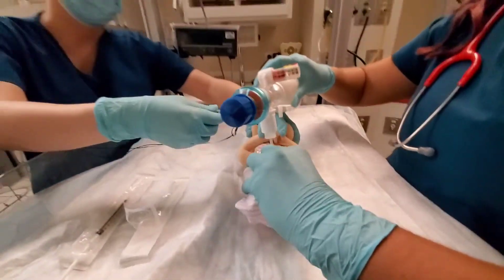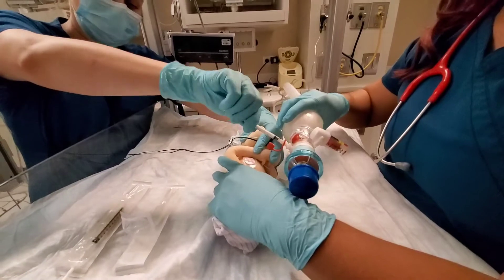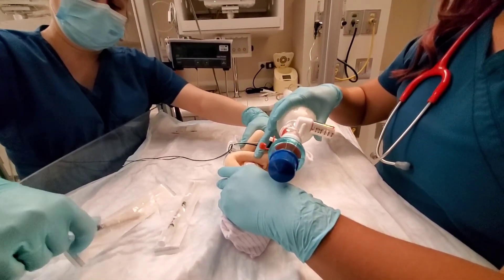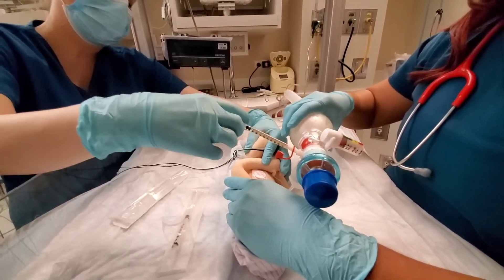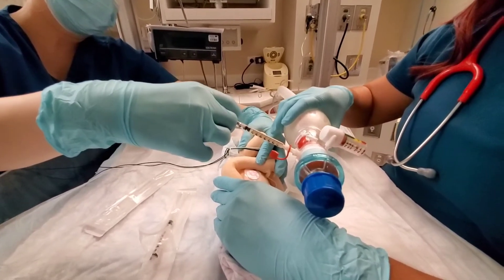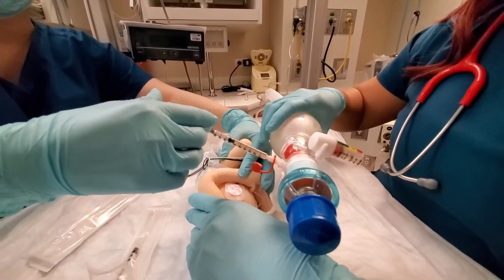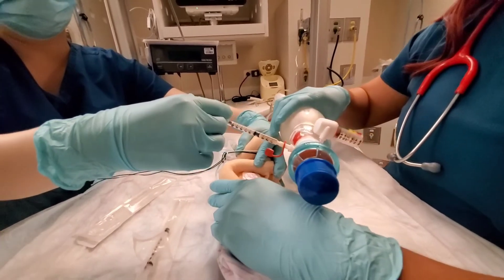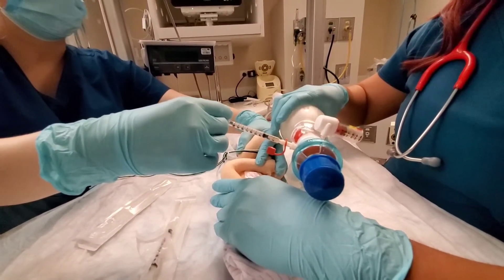So 30 seconds has transpired. We turn the baby once again as one unit — like the log rolling — keeping those knees flexed. The hands should always be on the baby, supporting the baby to stay calm. Heart rate is still doing well. Saturations still look good. Pressures are looking good.